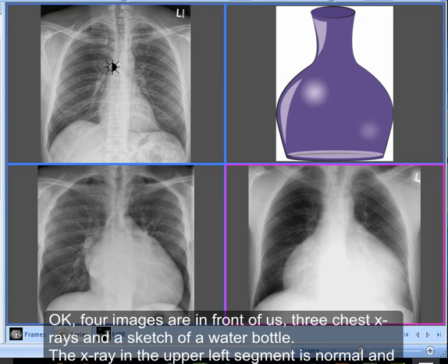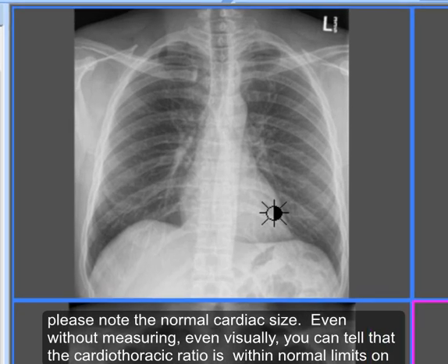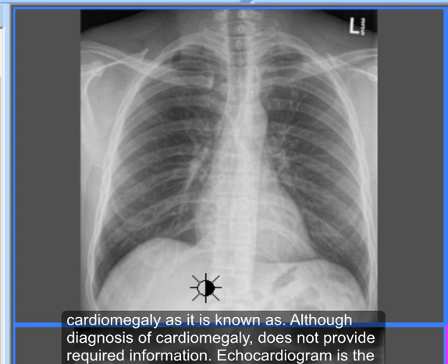Four images are in front of us: three chest X-rays and a sketch of a water bottle. The X-ray in the left upper segment is normal. Please note the normal cardiac size — even without measuring, visually you can tell that the cardiothoracic ratio is within normal limits. For those not aware of the term, the cardiothoracic ratio is helpful in the detection of an enlarged heart, or cardiomegaly.